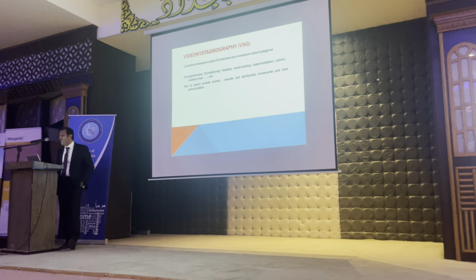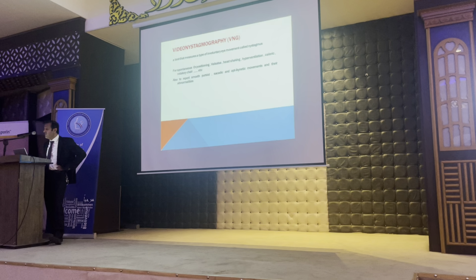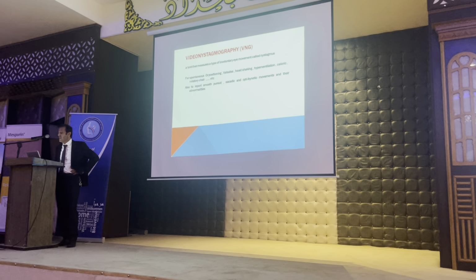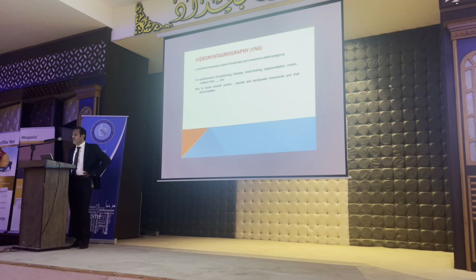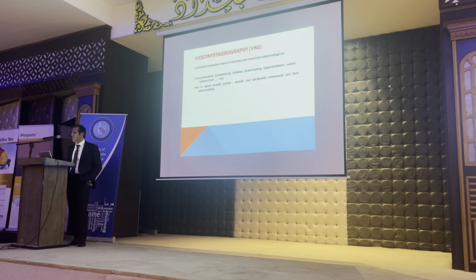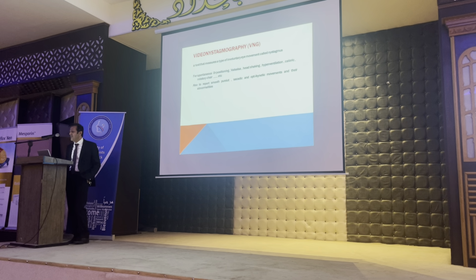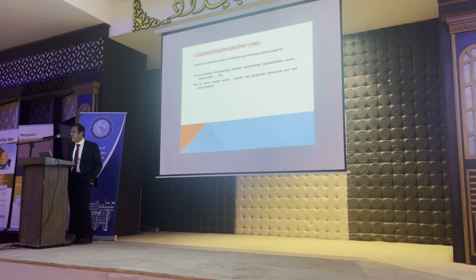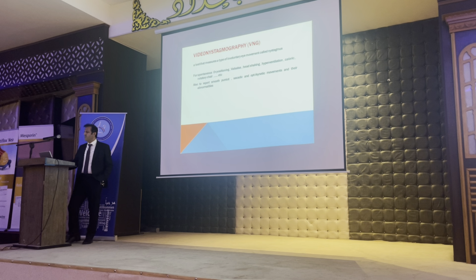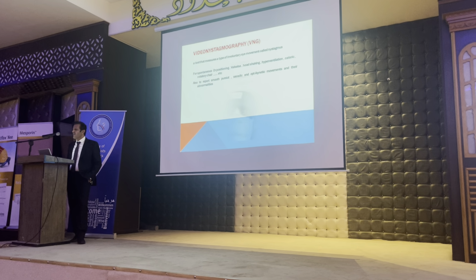Video nystagmography is a record of abnormal eye movement, which is nystagmus, and it also reports spontaneous, positioning, during Valsalva, with head shaking, with hyperventilation, caloric, and rotatory chair testing. It also reports smooth pursuit, saccades, and optokinetic movements, all of these.